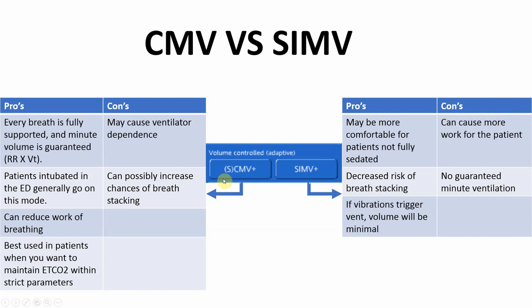A con to CMV is that it can possibly increase the chance of breath stacking. So if every single breath is fully supported, what could happen is if the patient does initiate a breath, they could initiate a breath immediately after the ventilator had delivered its predetermined breath that it gives that's timed after so many seconds, the vent says it's time to give another breath. If after that breath, the patient takes another spontaneous breath, they may have not fully exhaled yet. So the ventilator could deliver that breath if it's triggered, and it could lead to breath stacking.